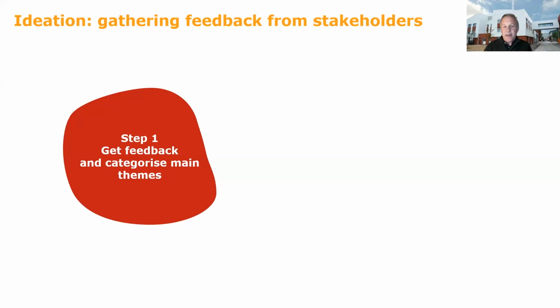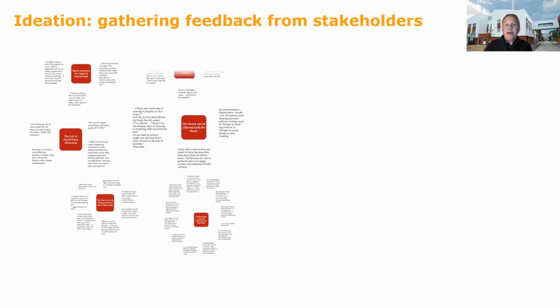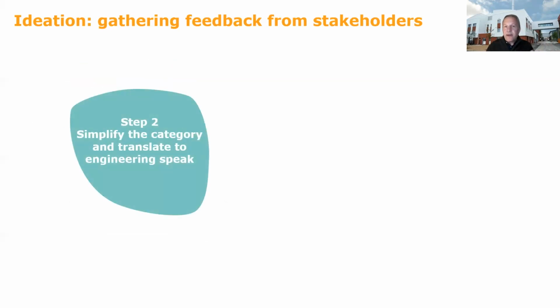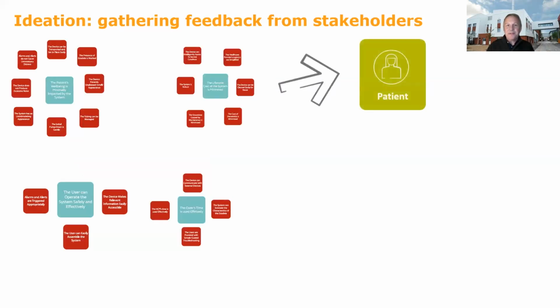We go from surgeons to biomed engineers, technicians, patients, clinicians, payers, all these people, and we gather the feedback from them. And we put all this feedback into categorized themes, as you can see here. We then translate that into engineering speak. An example is, we got a quotation from a patient who said, I just knew it was cumbersome and a pain in the behind to have on because you had to go to the bathroom with it. If you had to walk, you had to walk with it. And how did we translate that? Well, we turned that into: the device can be transported and set in place easily. That becomes a requirement for us to design this device.